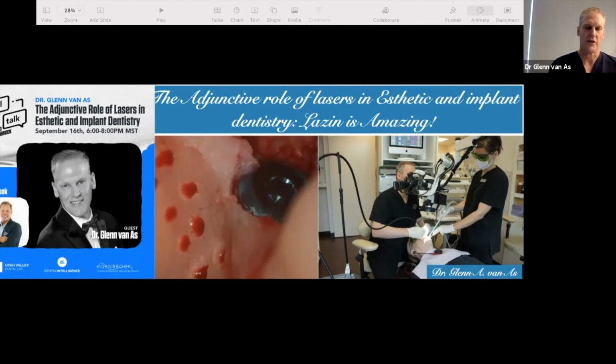You know that if you take off more enamel, you may not be able to do another veneer. You might be doing a crown, or why did my other veneers last so long and they never debonded? And 2 of the ones that you've just done have debonded within the first 3 months because you were into dentin, because you couldn't see, because the color was not that much different than the underlying tooth structure. It's difficult. And it's nice when you can say to the patient, hey, I'm going to get the veneers off and then we'll see what's underneath there. I'm not going to be cutting any tooth. And the sound of the drill cutting these things off is not fun, believe me. So it's a lot nicer if you can just pop them off.